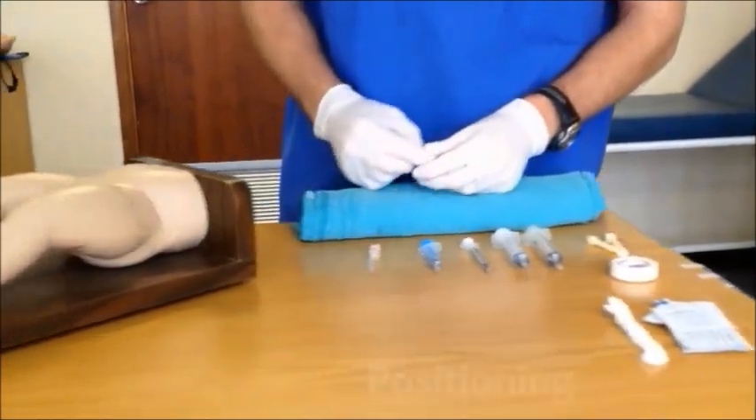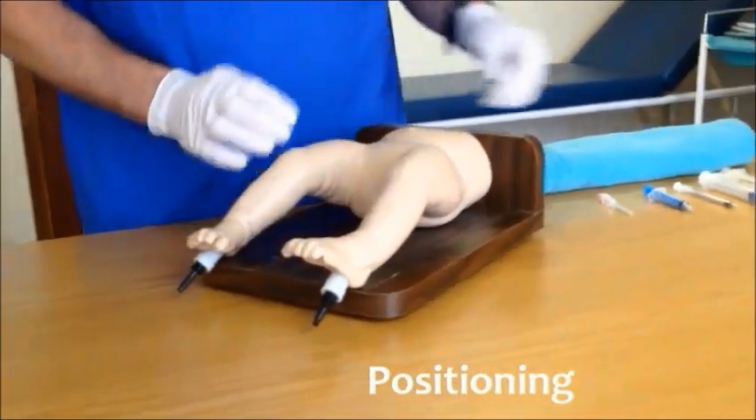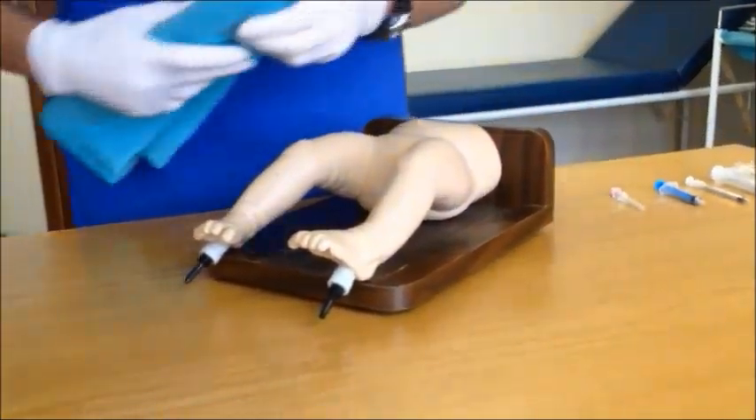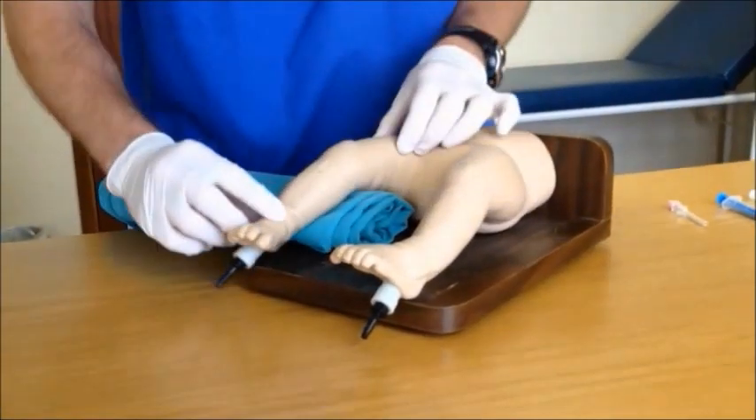The first step when inserting an intraosseous line in a child is to position the child correctly. The child should be on their back with a blanket roll behind the knee to keep the leg gently flexed.